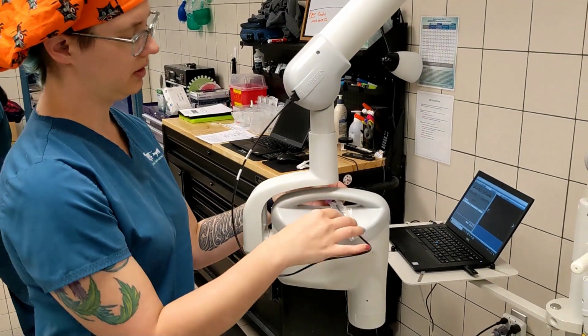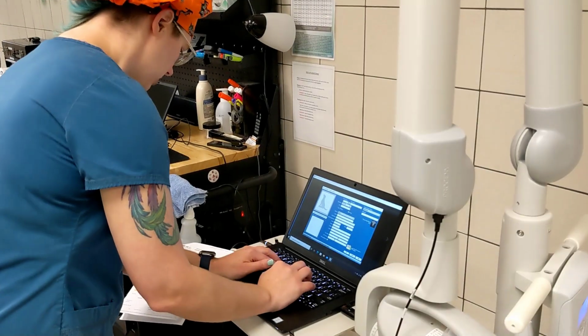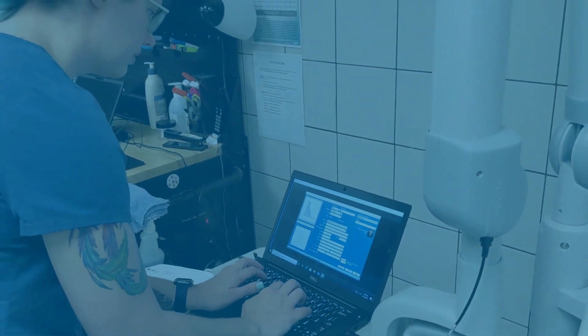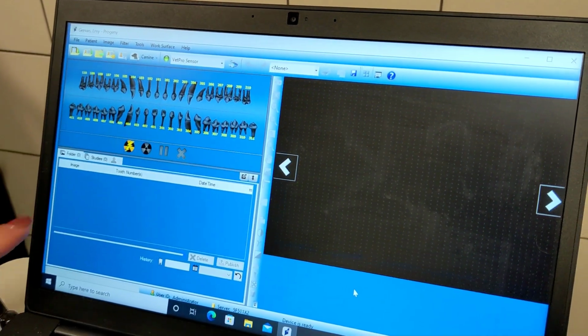When the sensor is plugged in, you should notice the software now is ready with a green notification at the top of the screen. The next step is to set up patient information in the software: enter patient name, age, animal ID number, and species. With these steps complete, the machine is now ready for use.